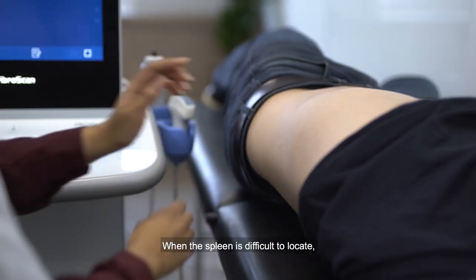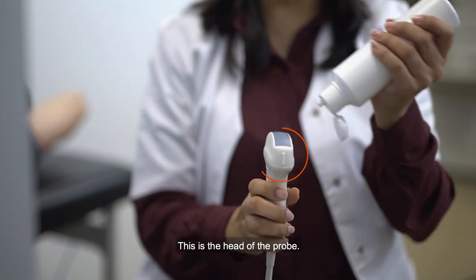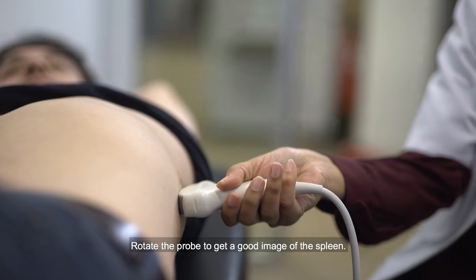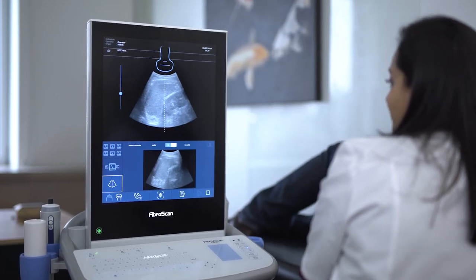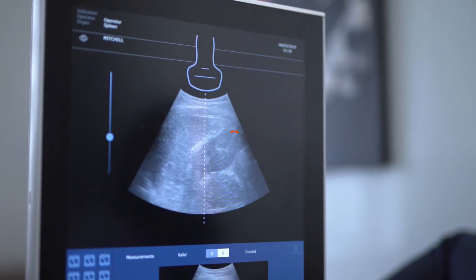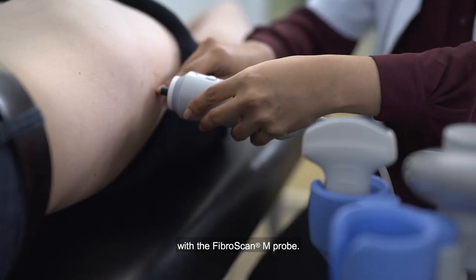When the spleen is difficult to locate, take the guidance probe and press the corresponding button. This is the head of the probe — it should point towards the patient's head. Place the probe on the patient's left abdominal side and rotate the probe to get a good image of the spleen. This is how the spleen should look; it is always anterior to the left kidney. Once the spleen is found, mark that point with a pen or with your finger and swap the probe with the FibroScan M probe.